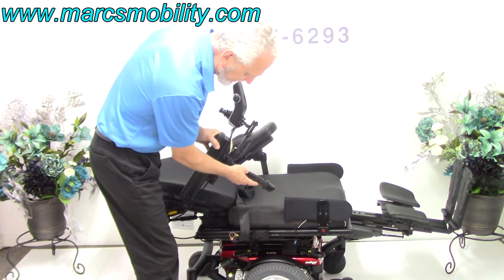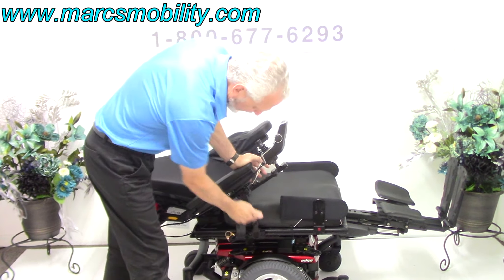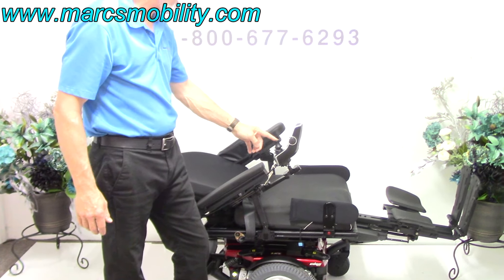Because this is an HD model, you've got arm support on both sides. When you're pushing on the arm, there's no give because you have additional reinforced support for your arms.